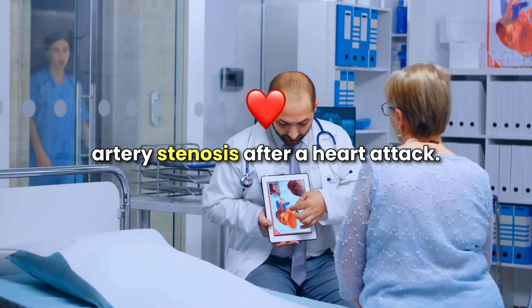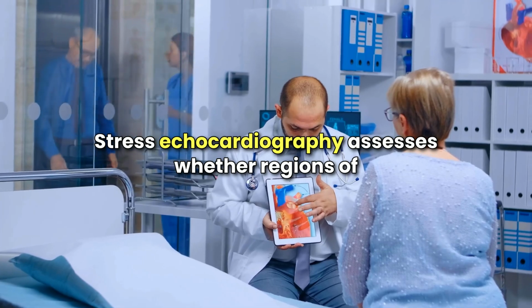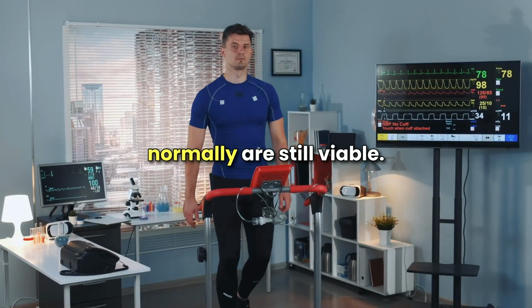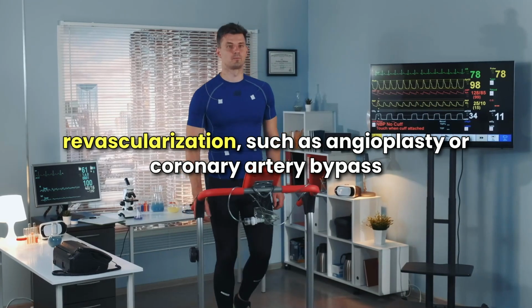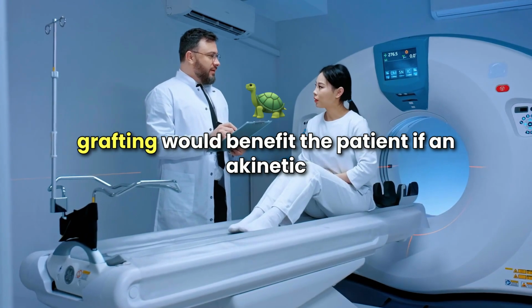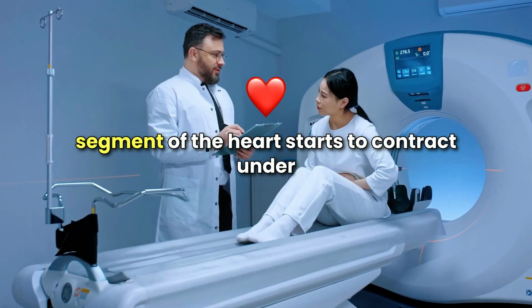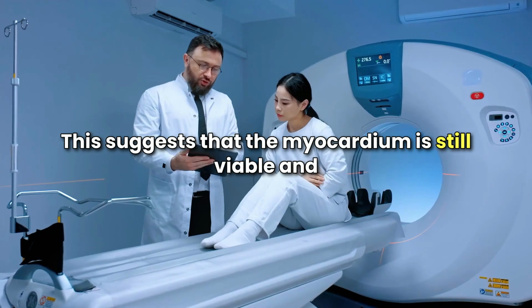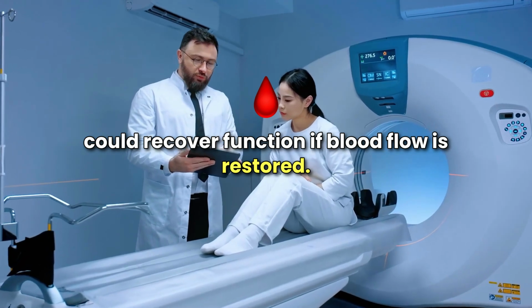artery stenosis. After a heart attack, stress echocardiography assesses whether regions of the heart muscle that aren't functioning normally are still viable. This is crucial in deciding whether procedures like revascularization, such as angioplasty or coronary artery bypass grafting, would benefit the patient. If an akinetic segment of the heart starts to contract under low doses of dobutamine, this suggests that the myocardium is still viable and could recover function if blood flow is restored.